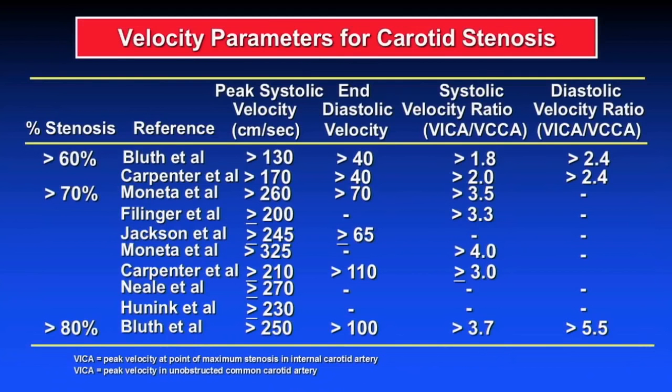And it would be nice if everyone agreed on numbers, but the reality is, and that's probably why most of you are here, there are a lot of different numbers out there in the literature, and everyone wants to know what are the right numbers. I'm asked that constantly. I don't care about the rest of what you said, just tell me what to use. It's not so simple.